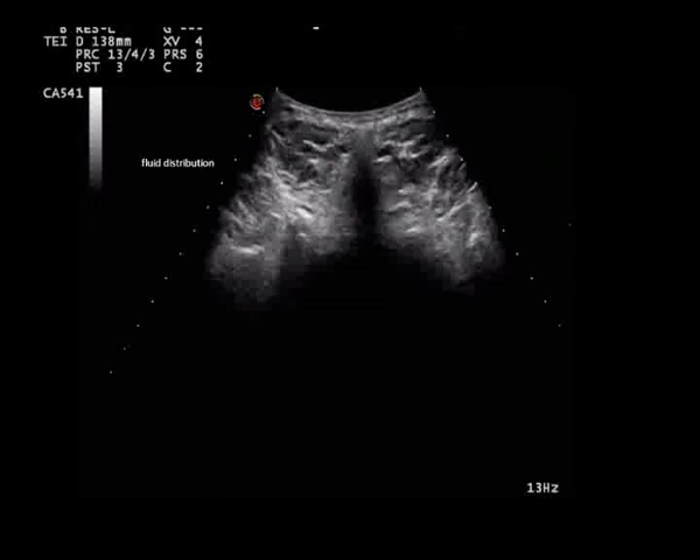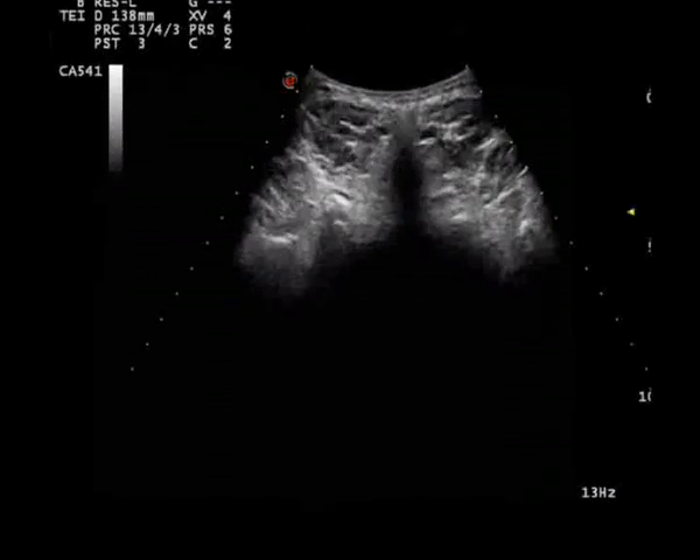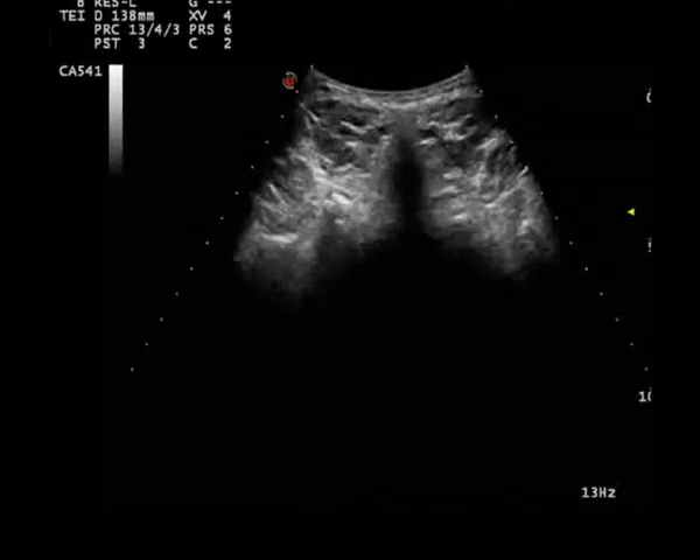So far, this procedure has been performed under fluoroscopic imaging with contrast agent, but ultrasound guidance will be a safer and better alternative in selected patients. Thank you very much.